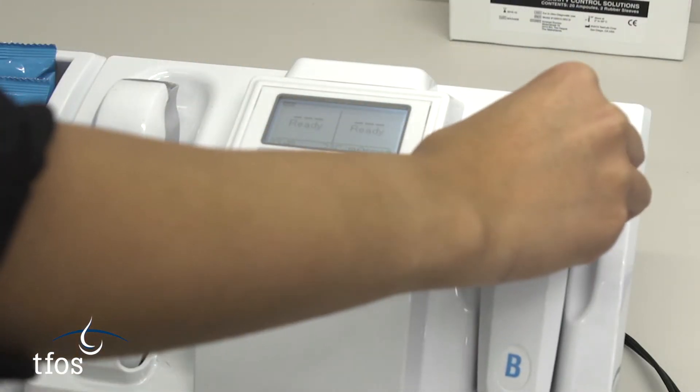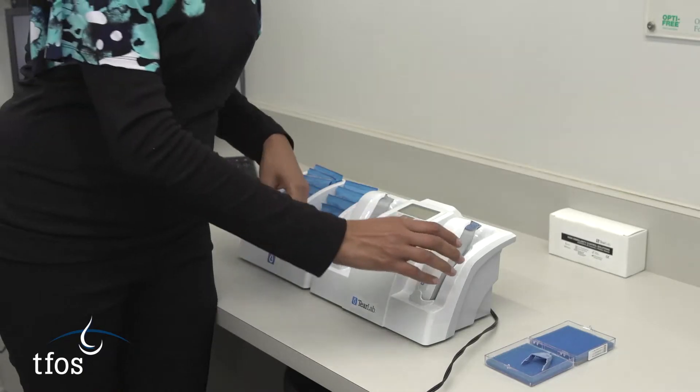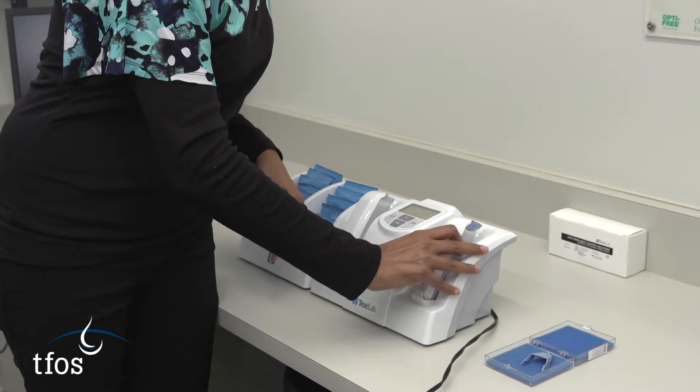The test card is clipped into the pen and the pen returned to its cradle. An osmolarity reading of 334 or 335 indicates acceptable calibration. The calibration card is then removed and stored.